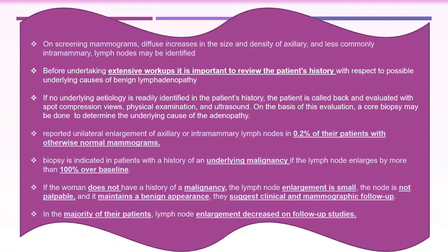But if the patient has no malignancy and the increase in size is just small, not much, and it still preserves the benign appearance, then we have to suggest a follow-up.